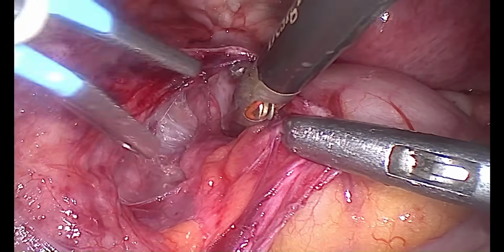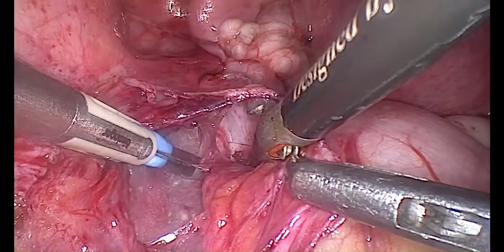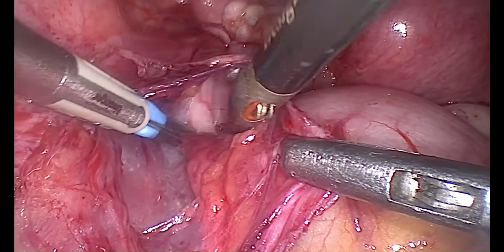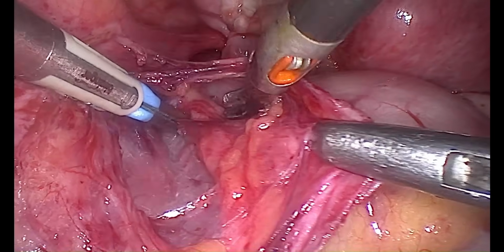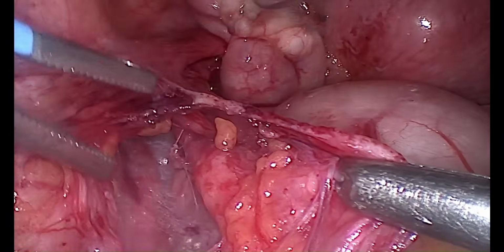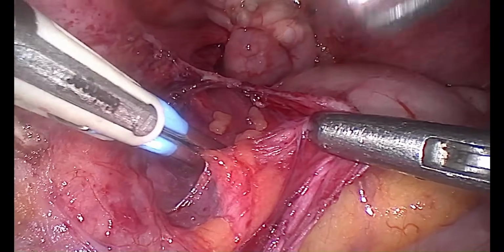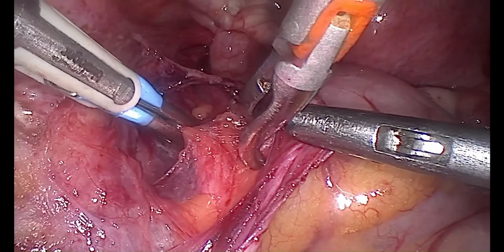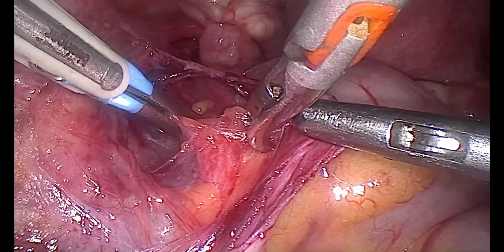If you are doing it in parallel ways, try to open the sub-sheath area, which is an avascular space, and this opening will allow more and more dissection further down. We use only three ports in our institute, and we are used to this: one on the lateral side of both sides and one in the central port.